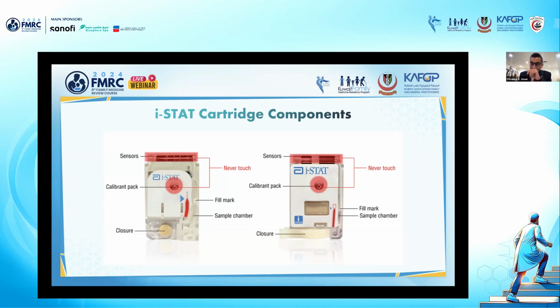And I will tell you something: the iStat device is just a reader. It's only to transfer the information from the cartridge to the screen to give you the result.